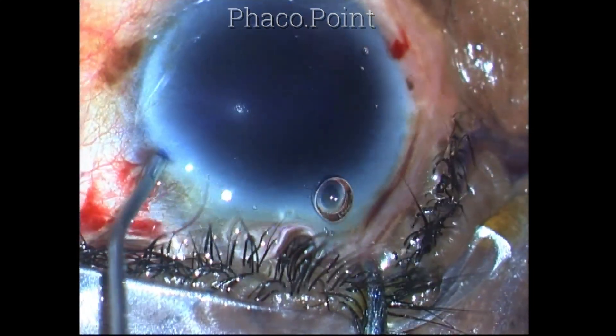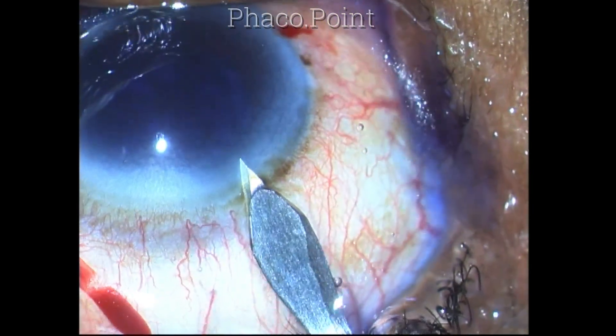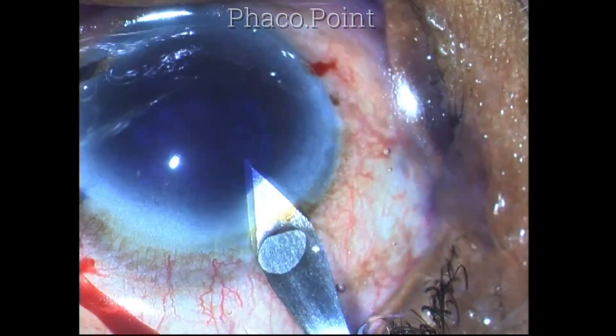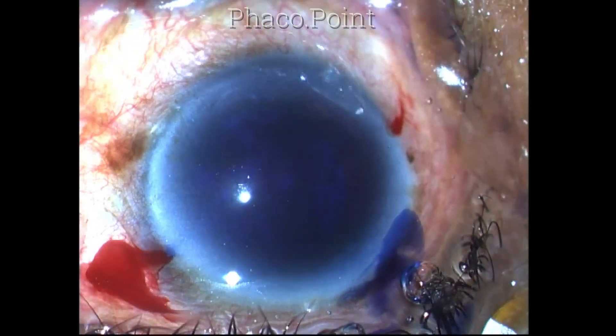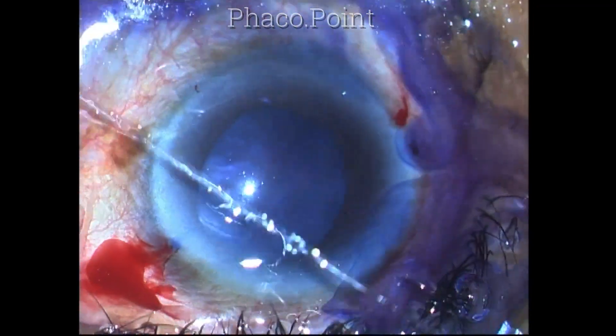The anterior capsule is stained with trypan blue and a clear corneal incision is carefully crafted. The patient was an 85-year-old lady who had advanced nuclear cataracts in both eyes.